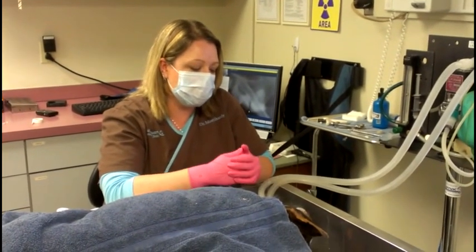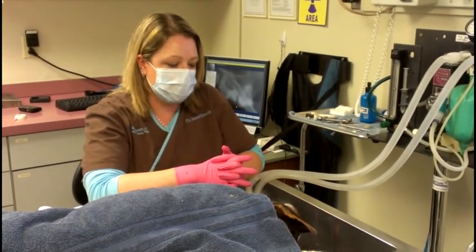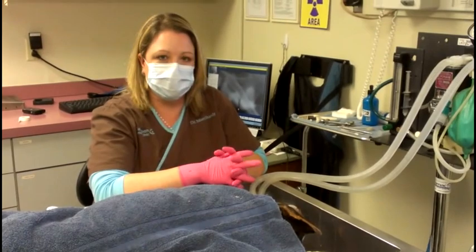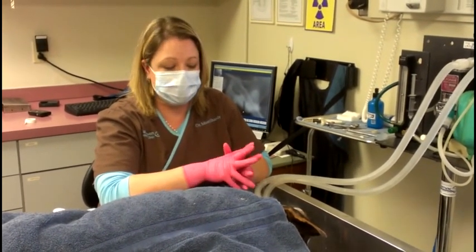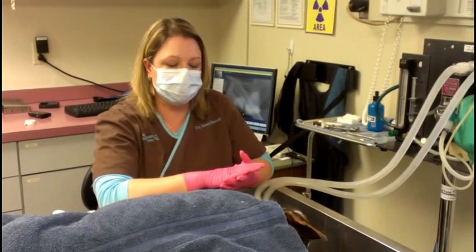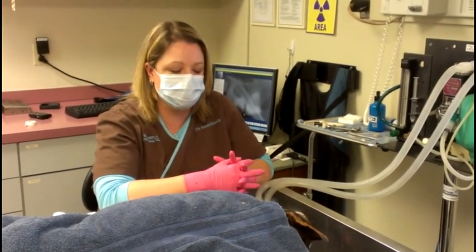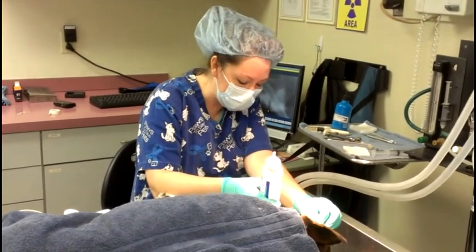So from this point, everything looks really good, and we're going to go ahead and have Dawna finish out what she needs to do to finish up our dental cleaning. The other thing we're going to do is give her an injection of an antibiotic. Anytime these guys have a dental cleaning, we're breaking free all the bacteria, and that can potentially go into their bloodstream and cause a systemic infection. So she'll also get an antibiotic injection today. Dr. Shardy has checked out all of Mabel's teeth and said they're healthy.